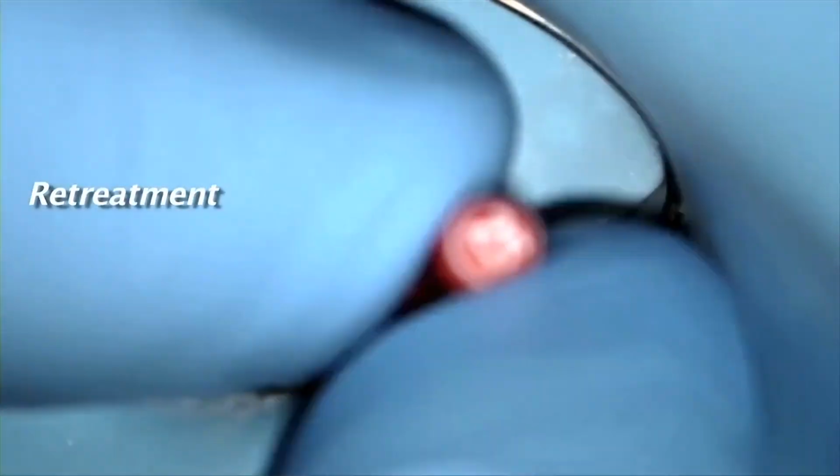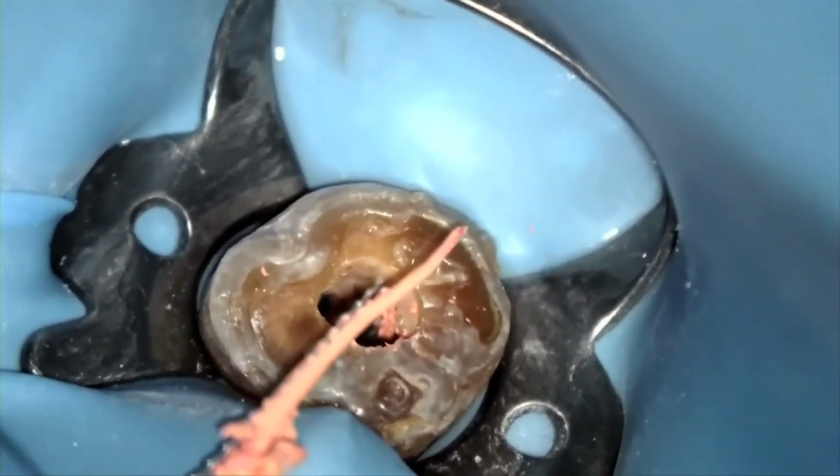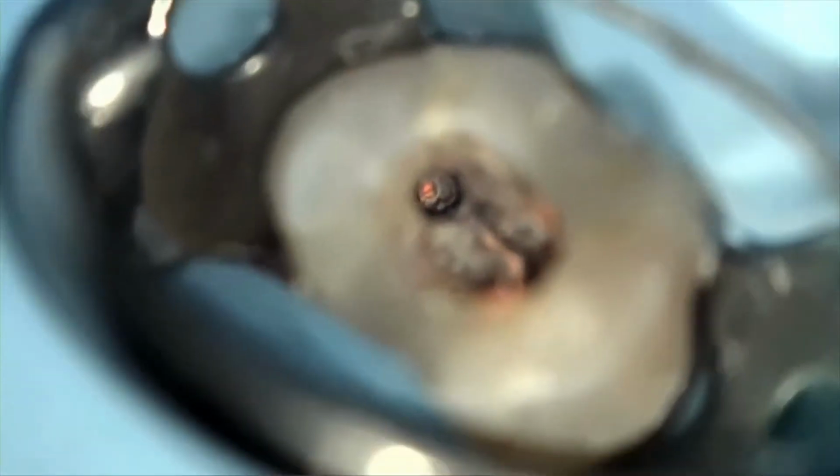One common misconception is that GuttaCore can't be retreated easily. As far as I'm concerned, anyone that says this obviously hasn't worked with GuttaCore. If you can retreat any gutta percha obturation, then you can retreat GuttaCore. There's no plastic or metal core in the GuttaCore, so it's really no different. It's all gutta percha, so this is not an issue at all.